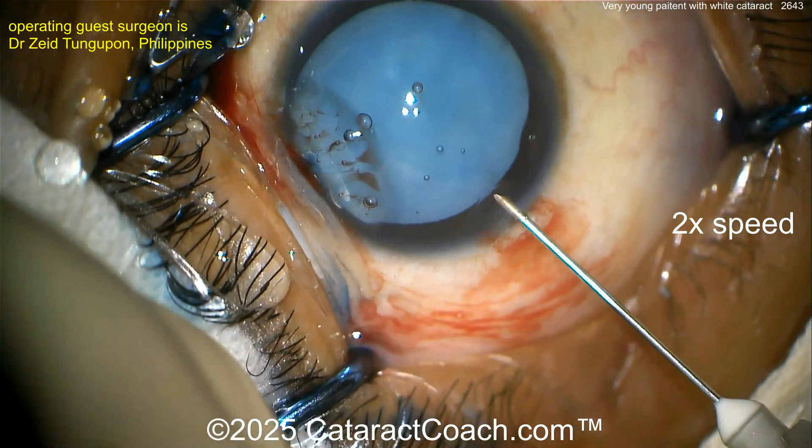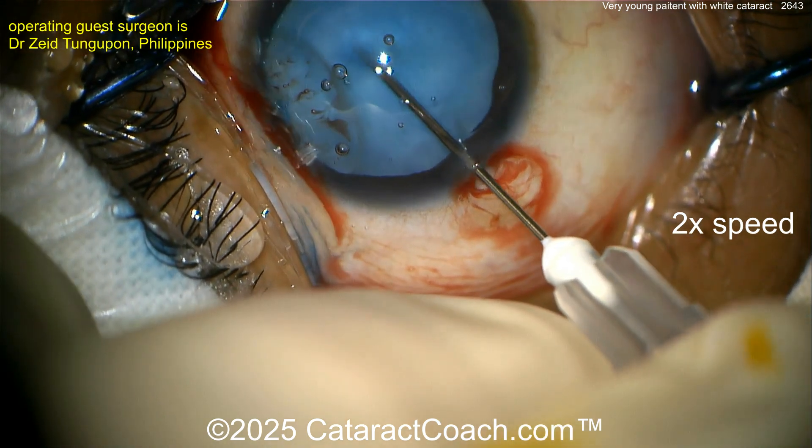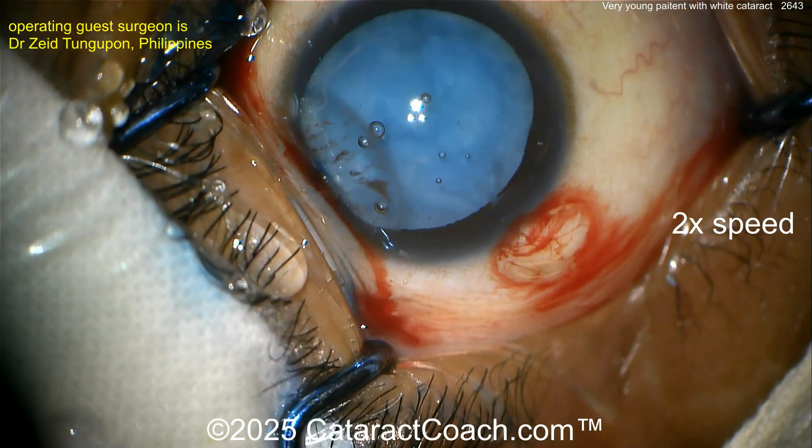Needle decompression. I like to first touch the anterior lens capsule with the cannula before using the needle, just to make sure it's not overly hydrated or overly pressurized. Good needle decompression. That looks pretty reasonable — must be a very small opening.